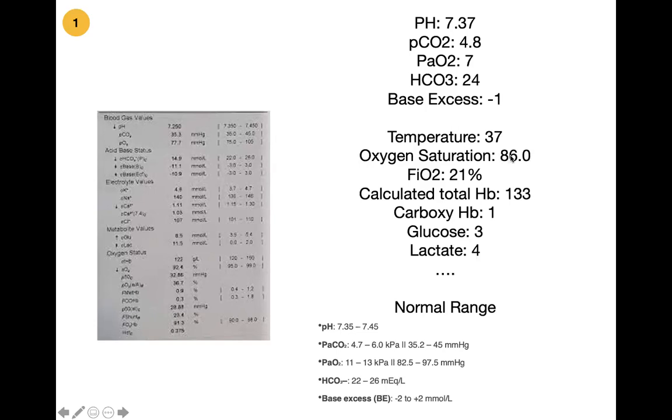So we can see here we've got worrying oxygen saturations as well. It also gives you other stuff you can quickly read off to get extra information. It gives you your hemoglobin, so we're not worried that this patient is anemic, that couldn't be contributing. And it gives you some other info that we'll talk about later, just to get us started.